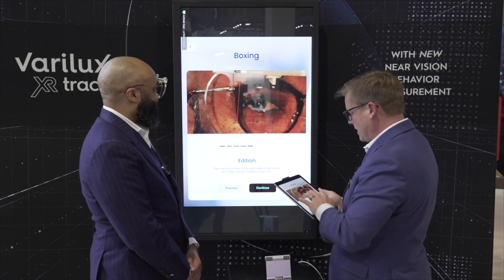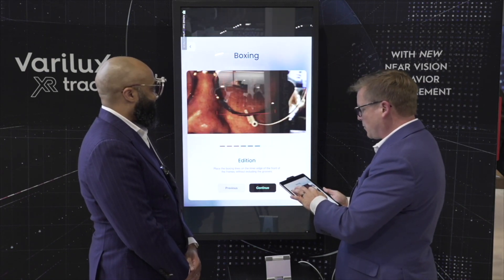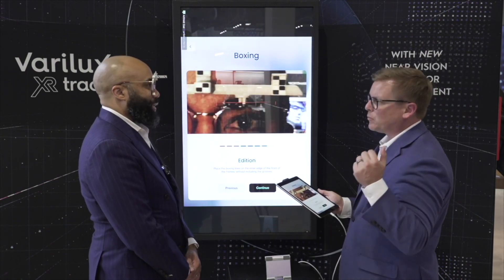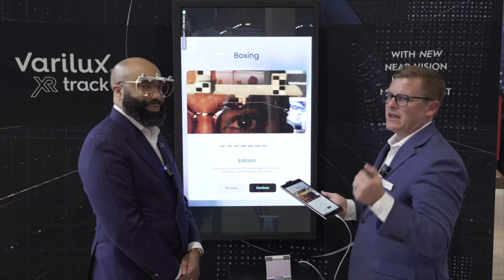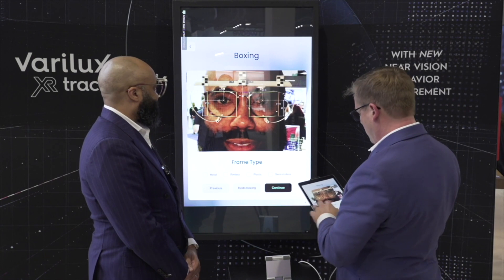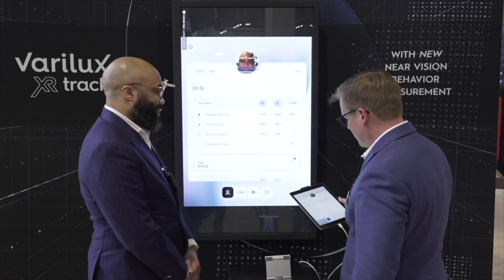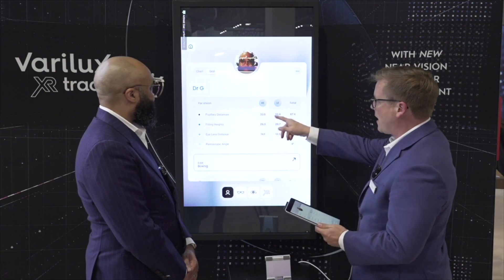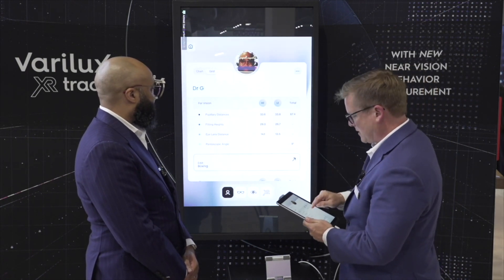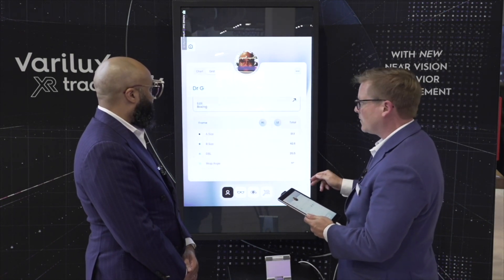The whole idea is we don't want to add significant additional time to the practice because you have limited time with patients. You've got pre-test, comprehensive eye exam, frame selection, dispensing, and so much more. Right here you pick your frame type — for example, a metal frame — and you can see mono PD, fitting heights, vertex distance, pantoscopic tilts, and all your frame measurements.